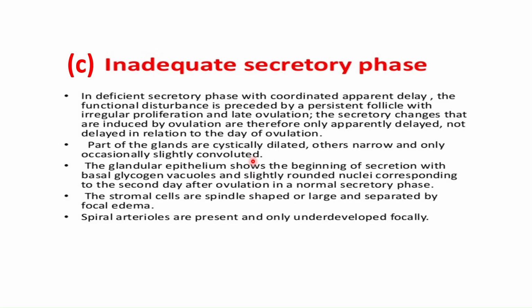Part of the glands are cystically dilated and others narrow and only occasionally slightly convoluted. So here the glands are dilated cystically, but the convolution is a little bit.